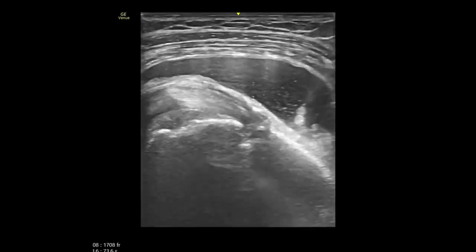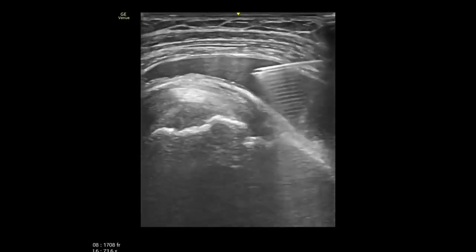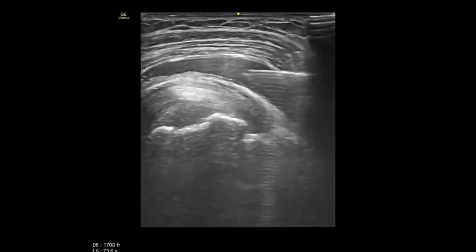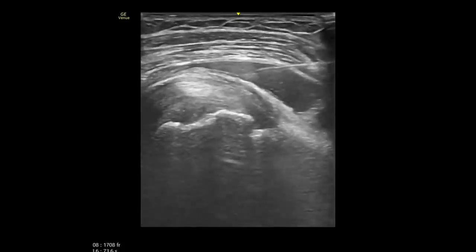She is the last patient who previously showed MRI findings of severe recurrent subacromial bursitis and diffuse subchondral bone marrow edema of the scapular glenoid and humeral head. I aspirated the subacromial bursa and performed an injection procedure for these two targets.